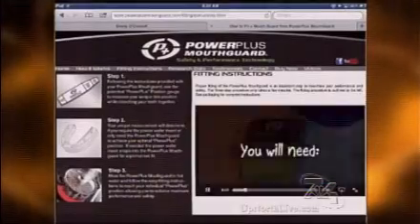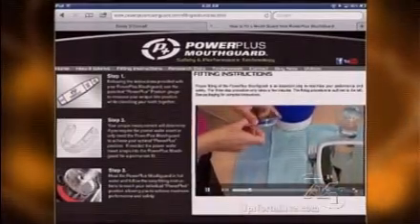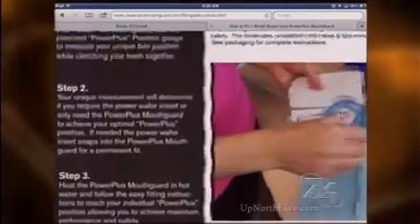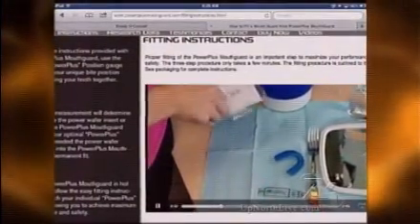So really? So yeah. How does it all work? Well, concussions is a hard topic because it's really hard to study it on live patients or people, because you just can't really say, hey, go out and see if you get a concussion or not. But it stabilizes your jaw. It puts your jaw in the physiologic rest position. That stabilizes the muscles from your shoulders to the top of your head. It also puts your jaw in a position that doesn't give you a greater impact to the bones under the skull. We're still studying it, but it's very promising because we have the results that we have.